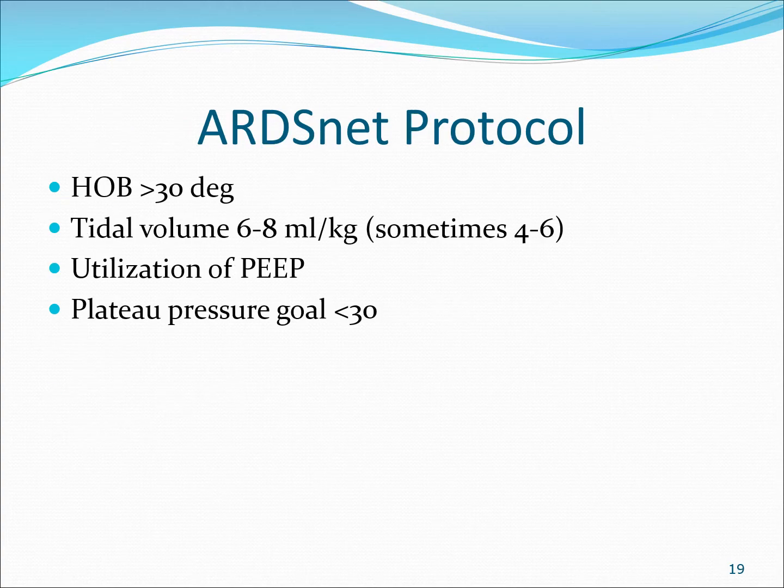I am sure you might have heard of the ARDSnet Protocol. They did a study. When I first became a respiratory therapist, we used to give 12 to 15 cc's per kilogram of tidal volume. And if someone was in ARDS and they weren't oxygenating well, we thought we should give them more tidal volume so they get a bigger breath. I mean, boy, were we wrong. Over time, we learned that lower tidal volume strategies work. Now, how do we know low tidal volume strategies work? It all came from the ARDSnet Protocol.